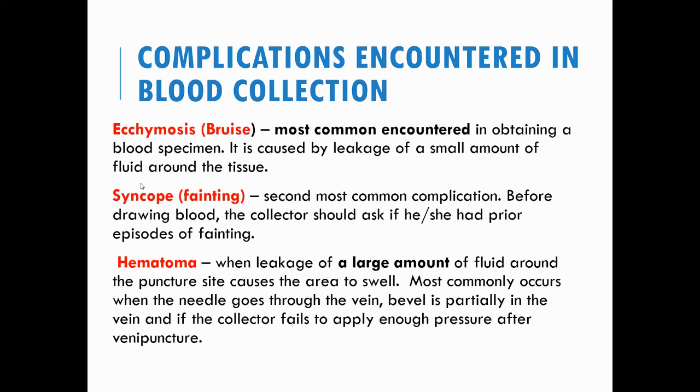A small amount is ecchymosis, but a large amount is hematoma. It commonly occurs when the needle goes through the vein and the bevel is only partially in the vein, or if the collector fails to apply enough pressure after the venipuncture. So instruct the patient to apply pressure for 5 minutes, or if the collector is excessively probing, hematoma can occur.